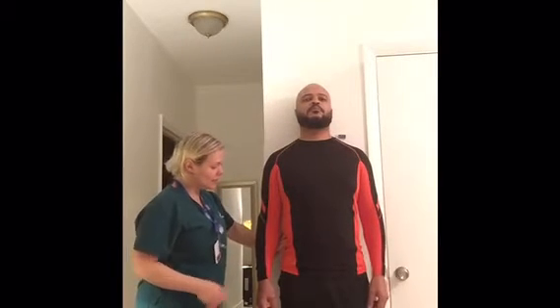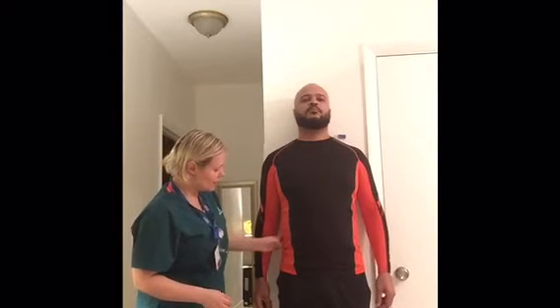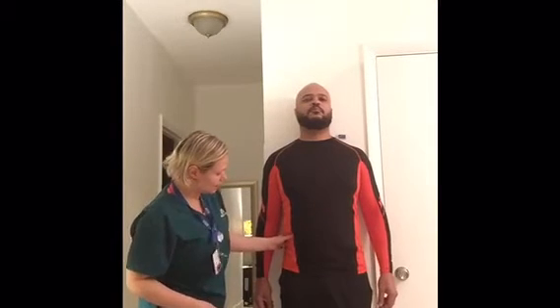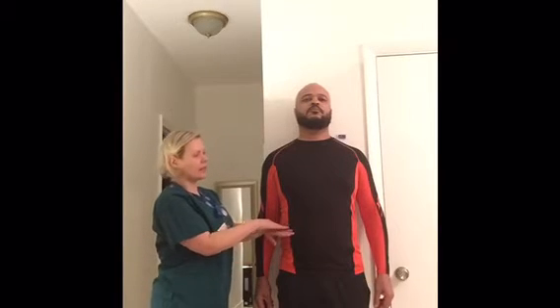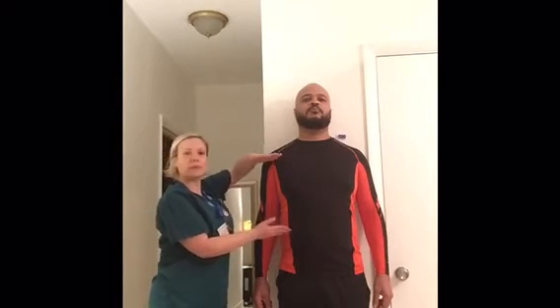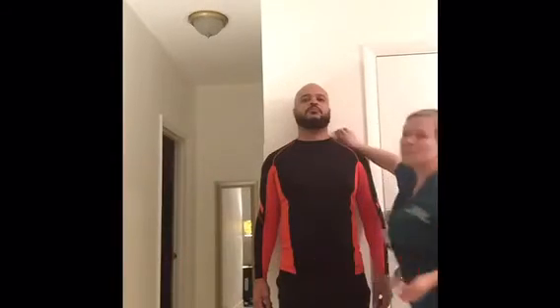Somehow I think that it will be easier. You see that the bottom of your IR is about the iliac crest. So if you have a doubt, you don't know, just palpate your patient. As your patient palpates the side, you have your iliac crest about here. So you have to have your IR above the iliac crest. And place your marker, and in this case just place it on the cassette.